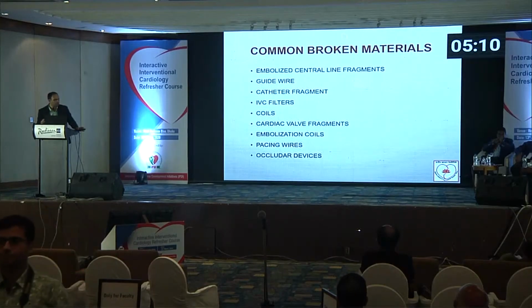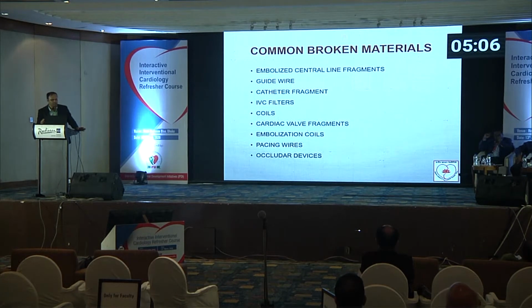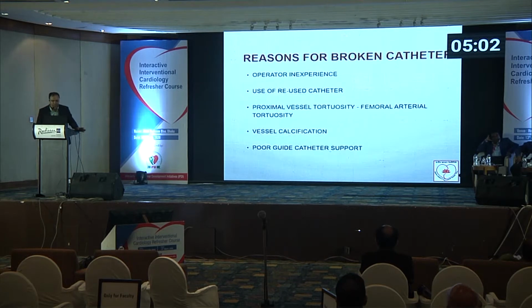What are the materials? It can be any material we use in interventions. It can be wires, balloons, coronary stents, catheters, or any imaging materials like OCT catheter tips or IVUS tips, rotablators, and all the devices used in interventions, and also sometimes guide access.